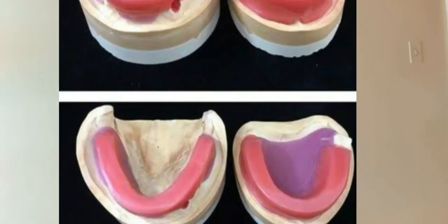Okay, now we come to our third appointment. The third appointment is the bite registration appointment. So Mr. Martin now comes back. Now we have our little wax blocks, right? The wax blocks are then placed into the patient's mouth. That's when the dentist will decide if the blocks are too high. If they're too high, we'll have to trim the blocks off. If they're too short, the dentist will have to add wax onto the wax blocks.